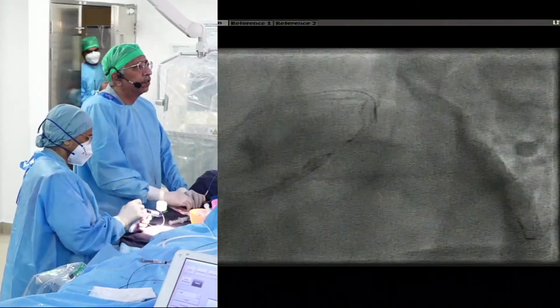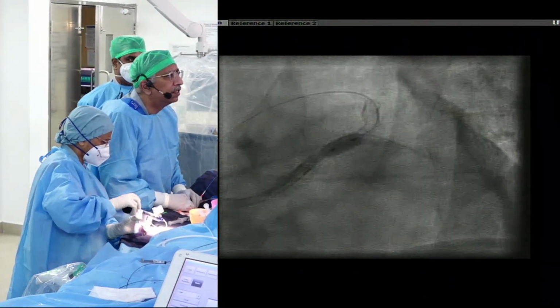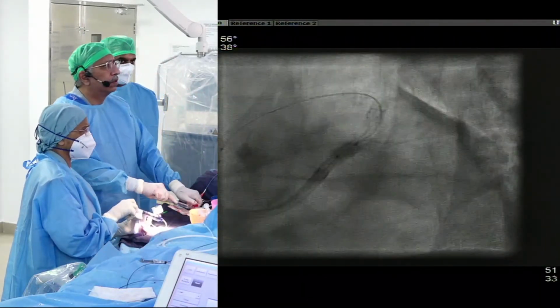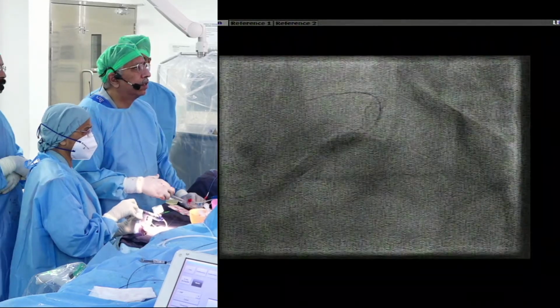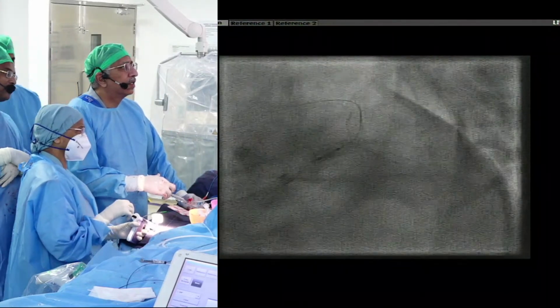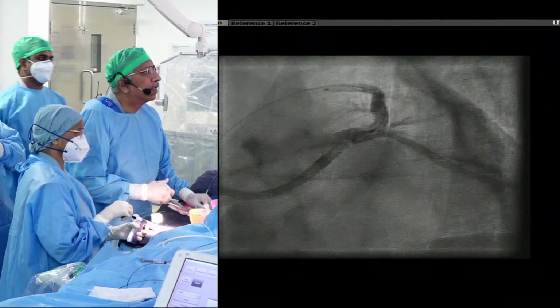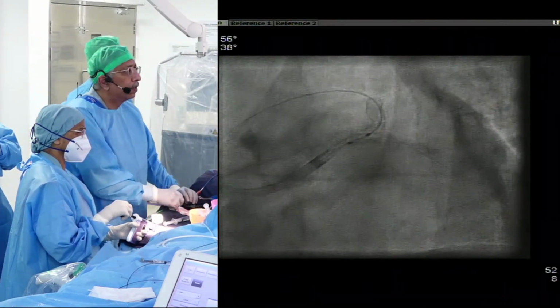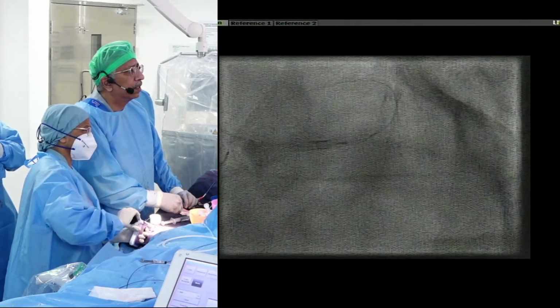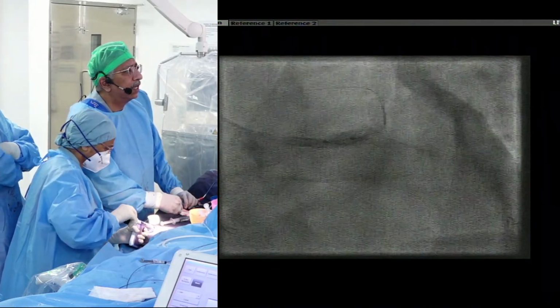We discharged the patient, who returned for an angioplasty with an OCT at 6 weeks, and you can see that it almost looks absolutely normal in the coronaries. The OCT at this point in time, 6 weeks later, clearly shows the vessel is absolutely cleaned up. There is just a little thrombus sitting there. We've now got 6 months OCTs on many of these patients, especially these red thrombi. We really see cleaning up of the vessels with warfarin and a single antiplatelet.